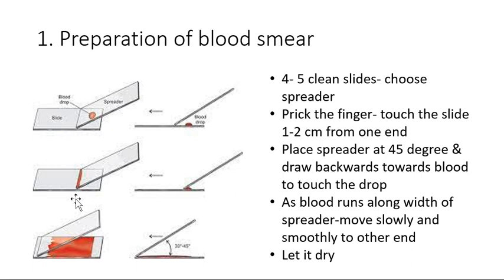Okay, as this is done, now you have to run the slide on opposite side, away from blood, and very smoothly with one stroke. Okay, it should be with uniform pressure. Fine. And then this smear is formed and you have to let it dry.